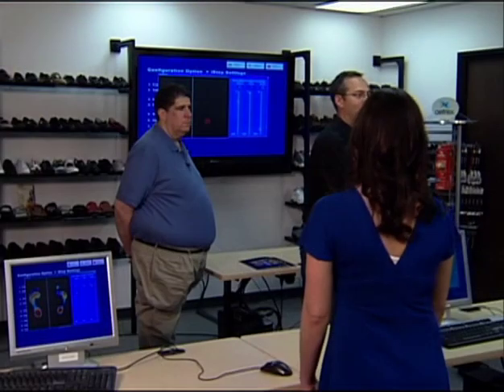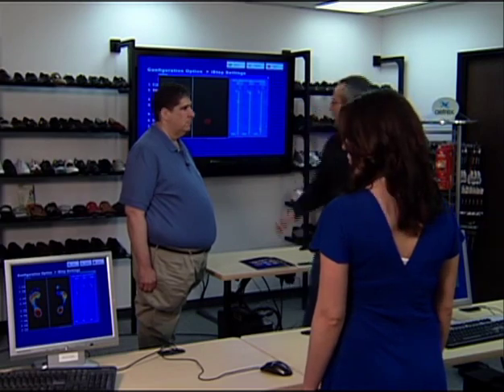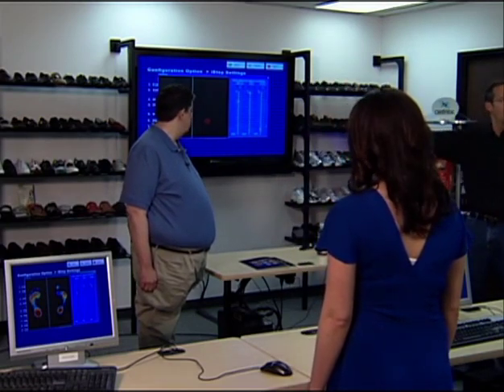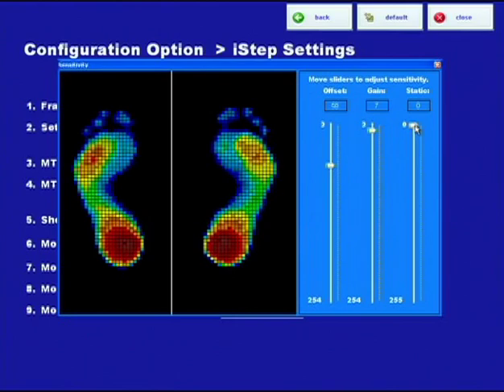If static reduction is at zero, that little speck of dust or something on the mat can trigger a sensor. But if it's too much, then your arch might not get picked up. Or in this extreme, nothing but the area with maximum pressure — the rear foot — got picked up. Since Dan's pants are rolled up, at zero it might still be pretty accurate. But we want to put it somewhere in the five to ten range typically. I'm going to leave it at five right now.